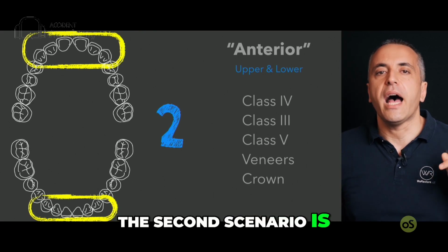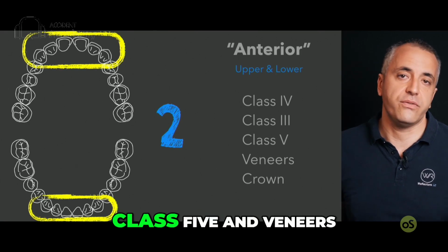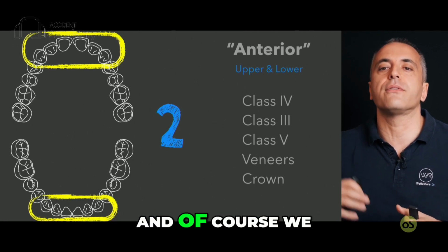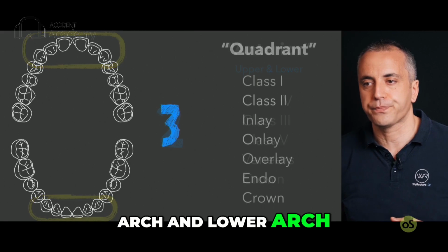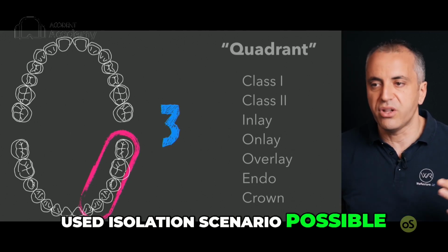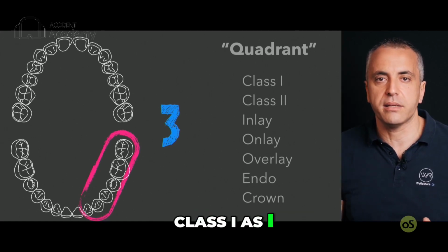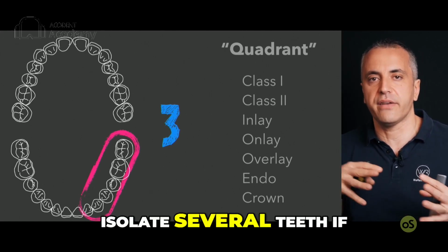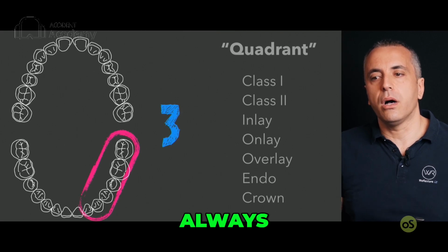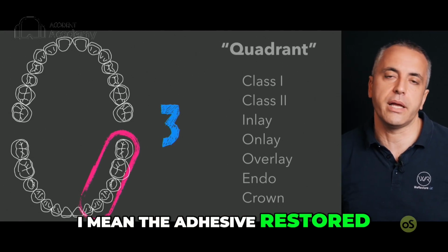The second scenario is anterior isolation. So what do we need this for? We need it for class 4, class 3, class 5, and veneers, cementation, and crowns in anteriors. And of course, we are talking about upper arch and lower arch. And the third, and maybe the most used isolation scenario possible, is the quadrant, when we isolate the whole quadrant in order to perform, for example, a class 1, as I said before, a class 2, of course, because we have to isolate several teeth if there is the interproximal area to be restored. Inlays, onlays, overlays, endo, multiple endo, for example, and of course, adhesively luted crowns.